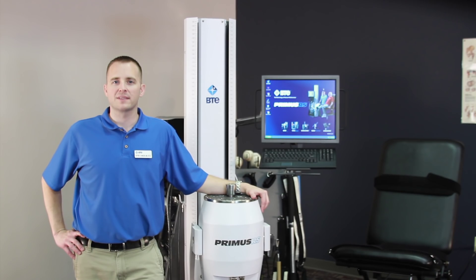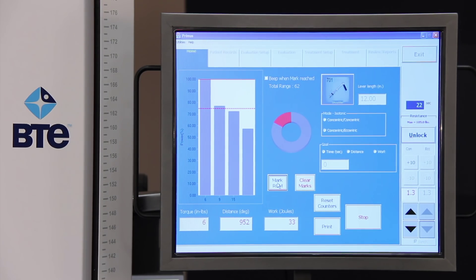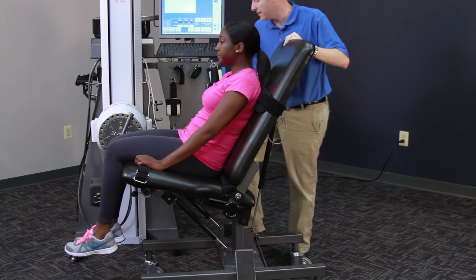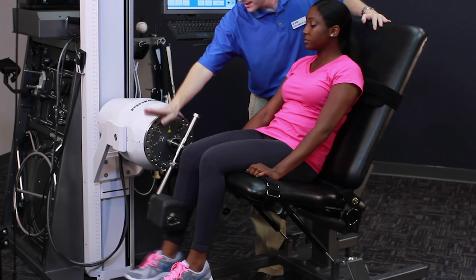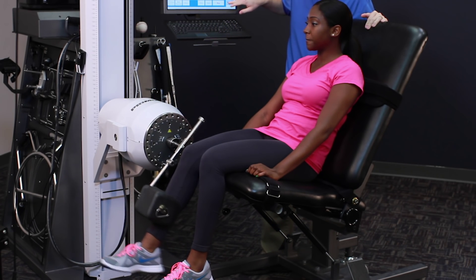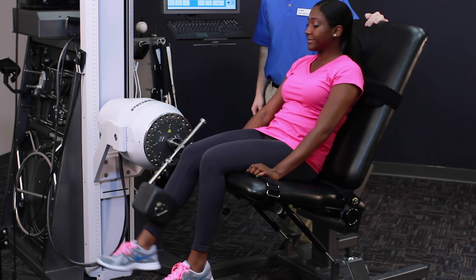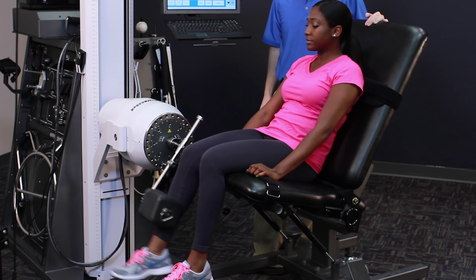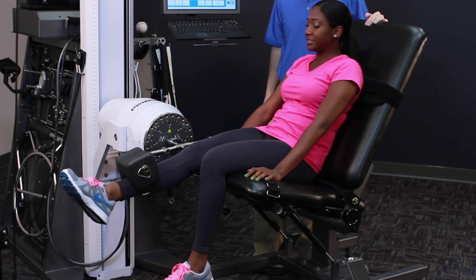If we set the Primus to the concentric-eccentric mode, the force of the machine makes strapping optional. For example, to isolate for knee flexion, remove the handle and replace it with a shin pad. In the software, we set the new lever length, then adjust the chair and place it into position with the appropriate depth. Next, we lower the workhead to isolate the knee, and finally set the seat back to a comfortable position for knee flexion and extension. The machine will push the patient back to the start position, providing eccentric muscle loading. Having your client work in a standing position will aid in increasing core stability and muscle control, the way we do in real life.